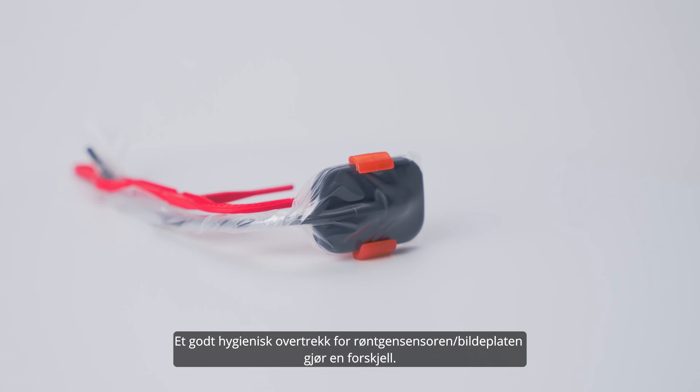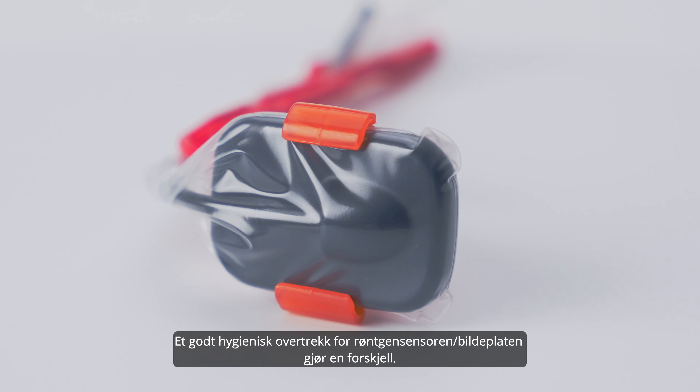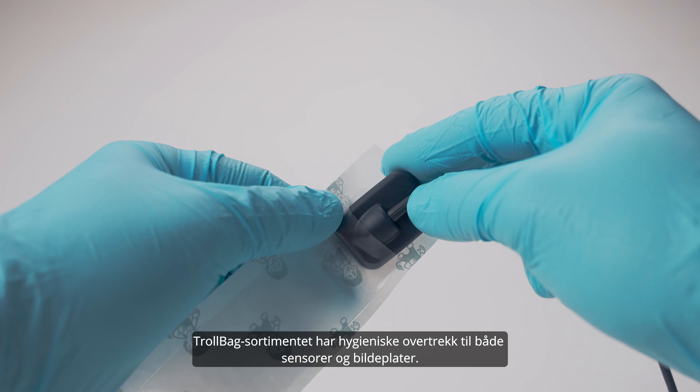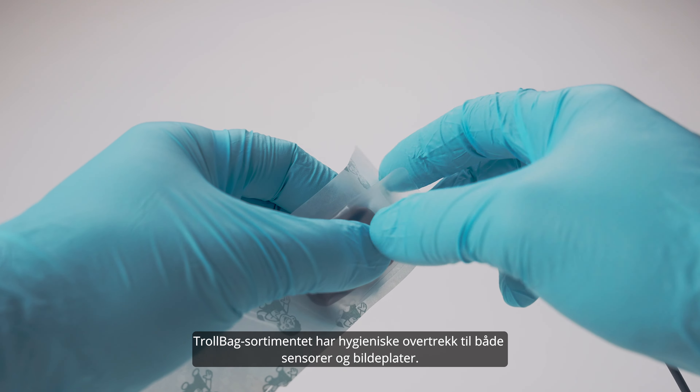A good hygienic cover for the x-ray sensors or image plate makes a difference. The Troll bag assortment offers hygienic covers for both sensors and image plates.